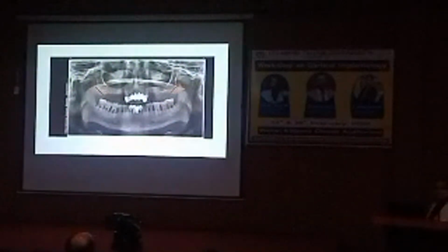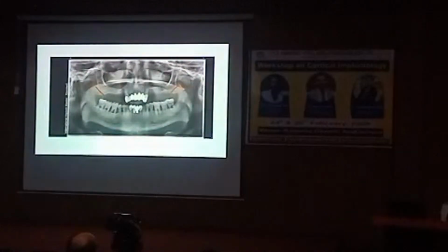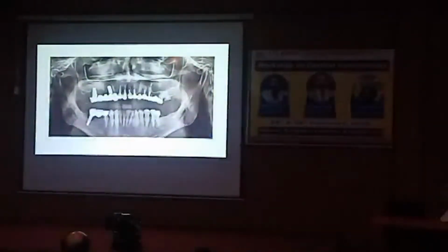And now we can very well justify that the vertical angle was a little shallow in the previous X-ray and a little more vertical in this X-ray. So vertical angle completely depends upon the patient's anatomy, and you should be able to read OPGs properly. So it is more vertical. I'll show you the after OPGs as well. In this case, we trace the tuberosities and we find the pterygoids very high. So definitely our vertical angle will be steeper.